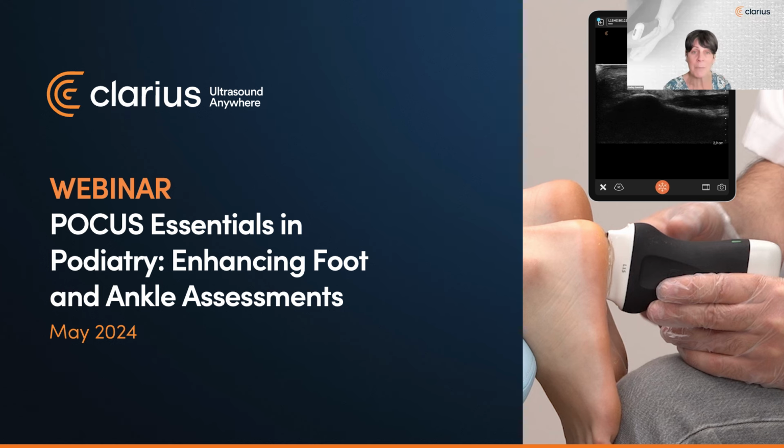In a moment, we'll be joined by renowned educator, Mr. Mark Schmitz, who will teach us sonoanatomy, teaching us his scanning skills and pathologies that you may come across in your practice.